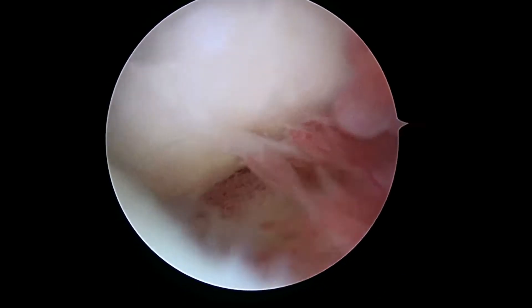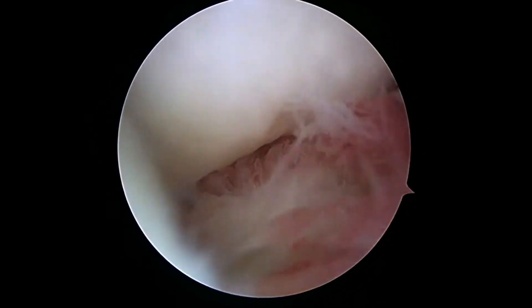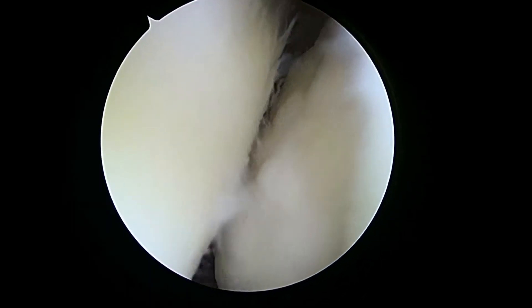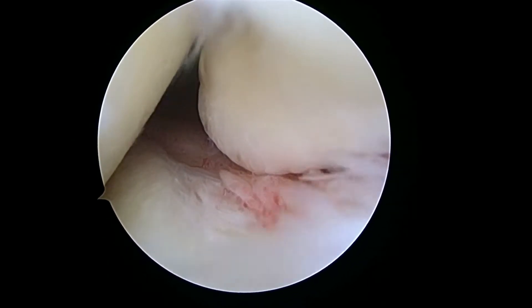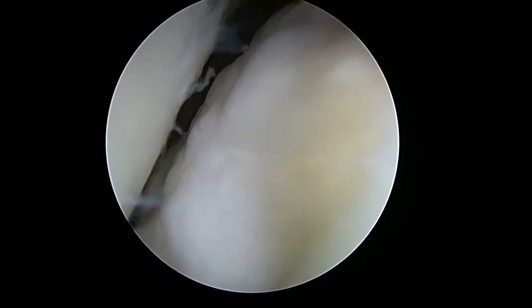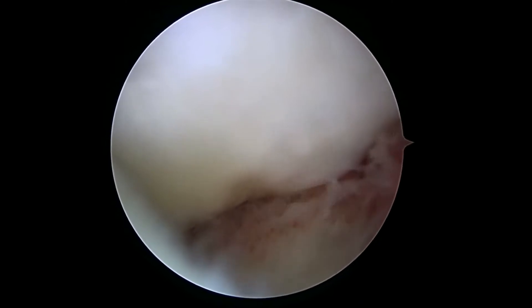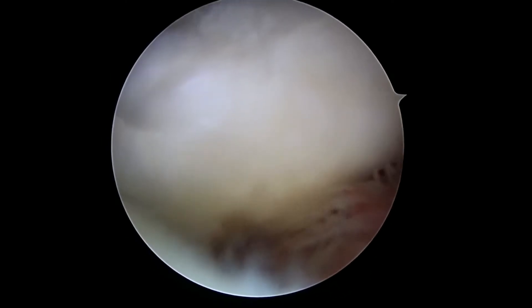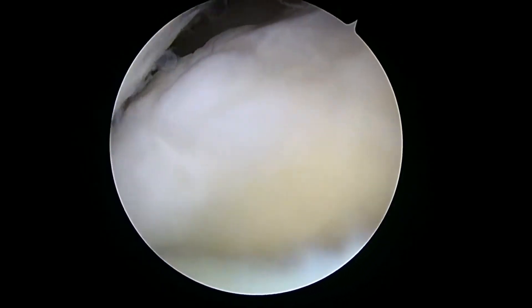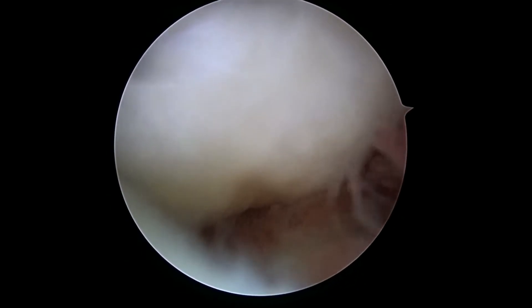Look at this huge loose body in the back of your knee. We saw that on the MRI and it's so big it's taken up most of my view. You can see it all the way from the very back all the way around. You can see it's moving around — I can't imagine this wasn't causing you pain. We're going to do everything we can to try to get it out. It's a little bit more complex. It looks almost like it's swelled up even since the MRI because this is huge. So we're going to get ourselves situated, take a look at it, and try to get ready to take it out. I'll show you what it looks like once we're done.